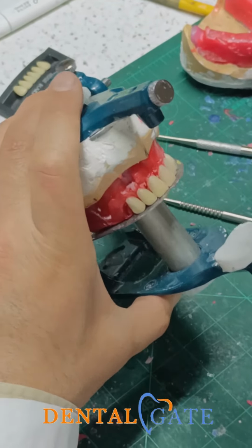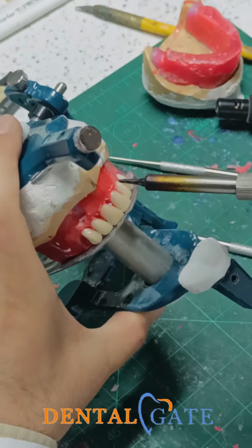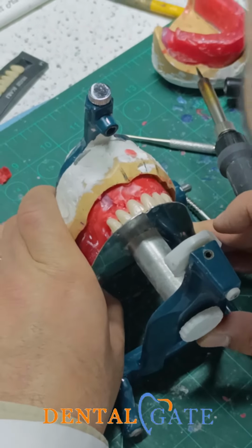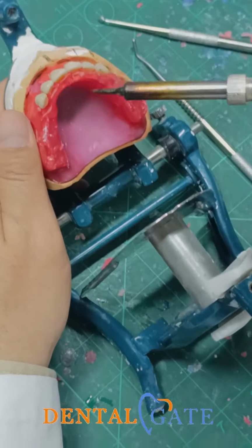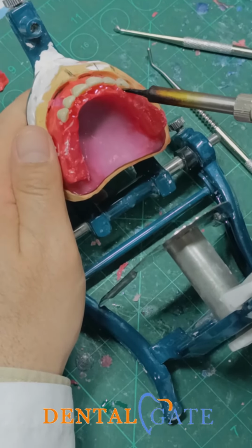Okay, if you want to evaluate your arrangement, make a final sealing here, and be sure the midline is in the correct position. Don't pay attention to this table, because this table is not good. So I had a reference here with the midline. So make a sealing here to provide final luting to the teeth.